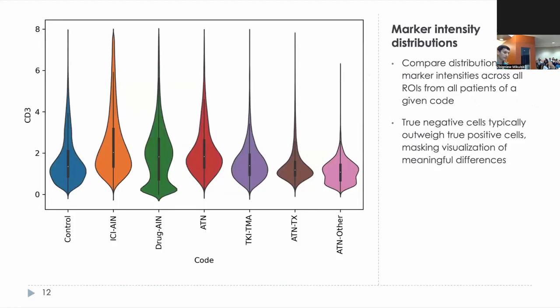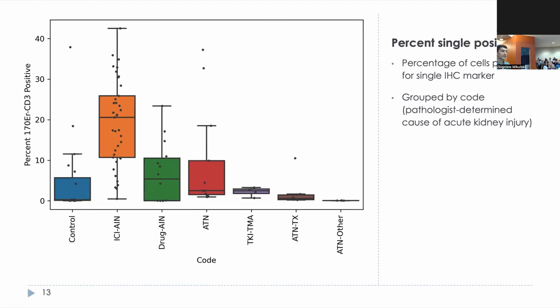Independent of cell classifications, we can visualize marker intensity distributions grouped by the cause of immune checkpoint inhibitor damage. Shown here is the mean CD3 intensity of all cells grouped by AKI code. Visually, it may not appear that there is much discernible difference, because the intensities of true negative cells typically outweigh those of true positive cells. Unless over half of your cells are immune cells — which would be very bad for the patient — you have to isolate your individual immune cells and visualize them accordingly. By applying our pathology-supervised thresholds, we can identify the positive population and find the percentage of cells positive for individual markers, as shown here for CD3.